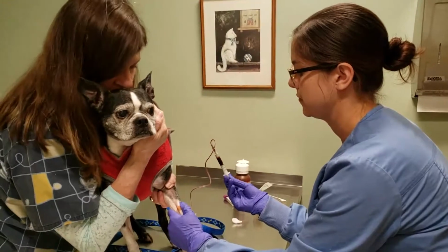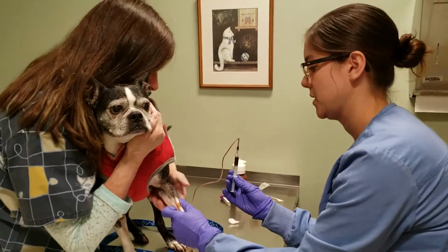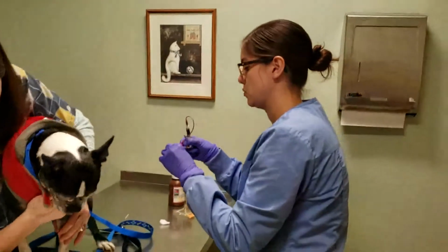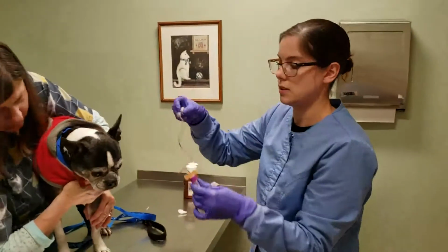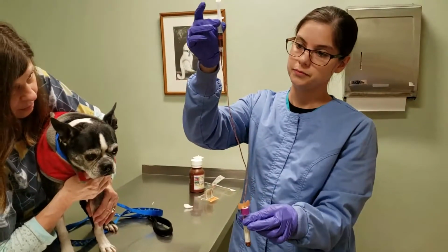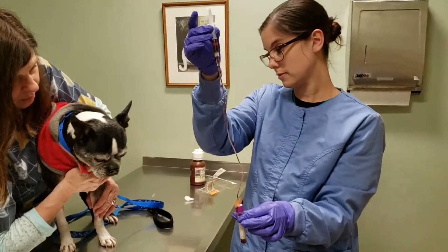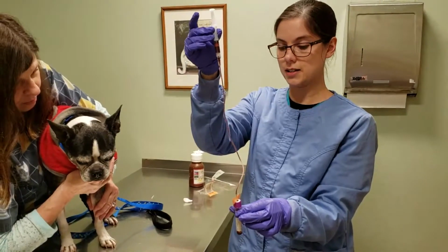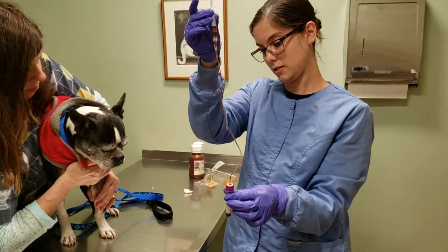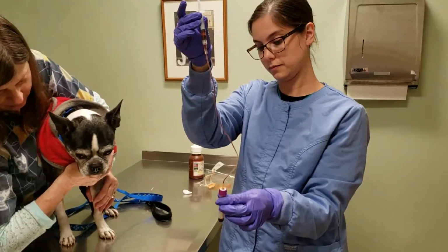So I'll do a little bit more. Okay. So now we will put it into our purple top. Let it flow in on its own. You're such a good guy. You are a good boy.